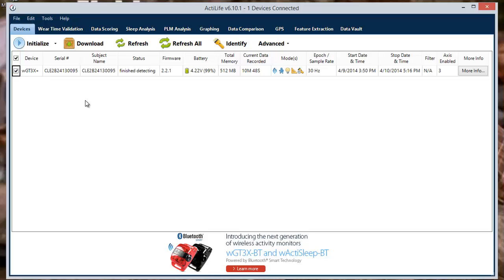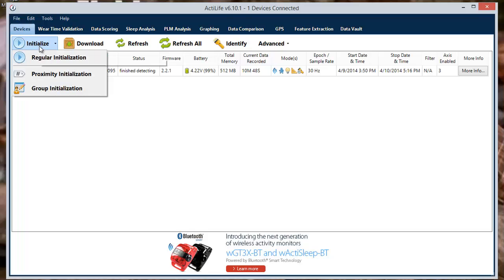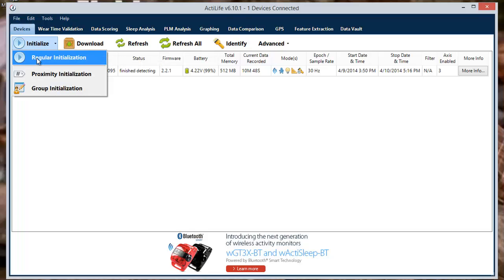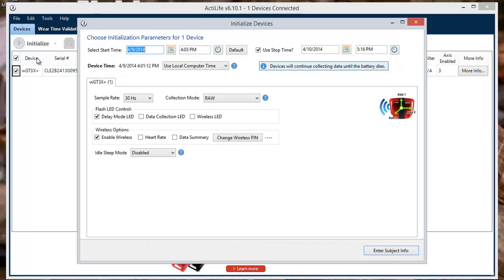Please ensure that the device doesn't contain any needed data, as the initialization process will erase all data stored on the device. The initialization options can now be clicked and we can proceed with the regular initialization. This will prompt the initialization floating window to set your parameters.